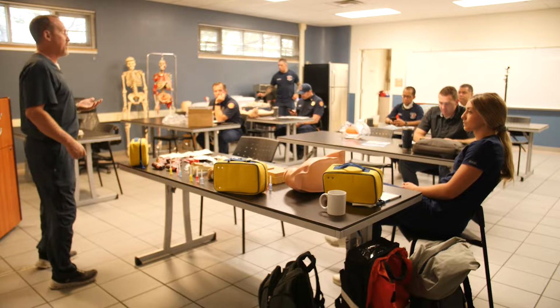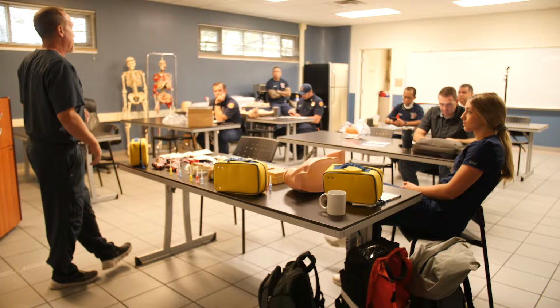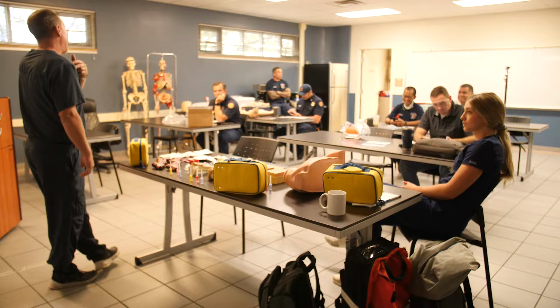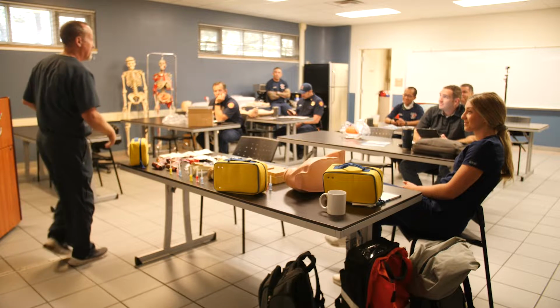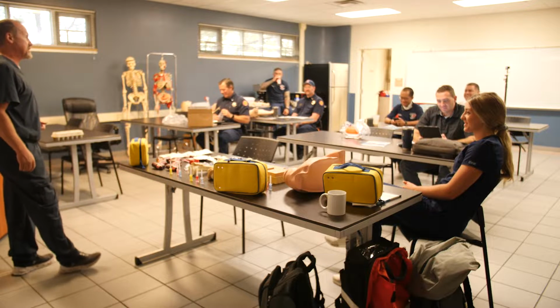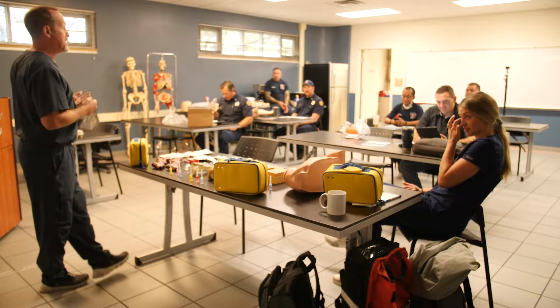A perfect example is that maybe you've got a big bodybuilder, a super, super buff person. They've got a lot of muscle mass and you're trying to go into the proximal humerus and you just can't feel that humeral head. Well, bodybuilders always skip leg days, so we know we can go to the tibia, and we can probably find a bony prominence down there. So those are really the only contraindications for this product.